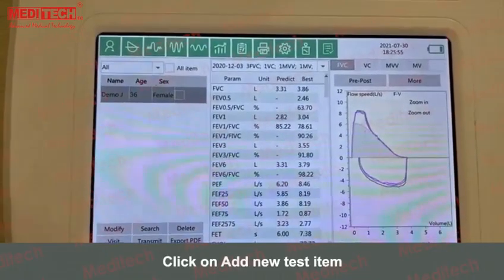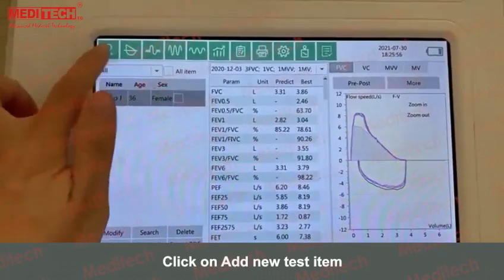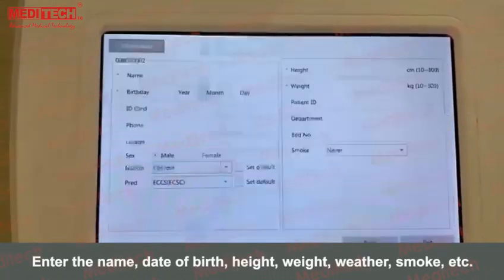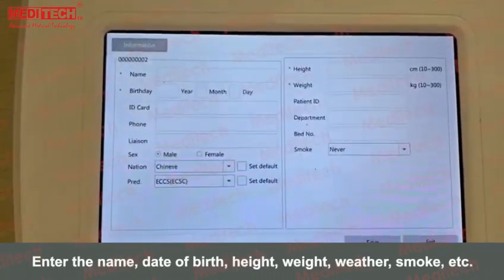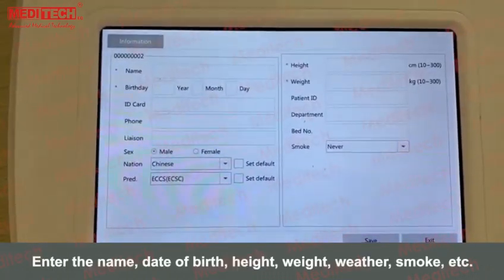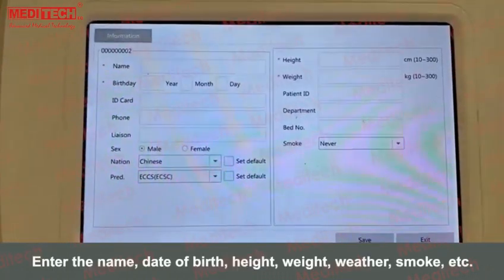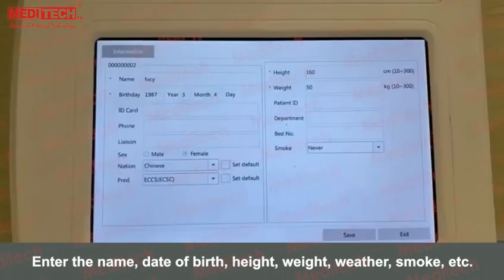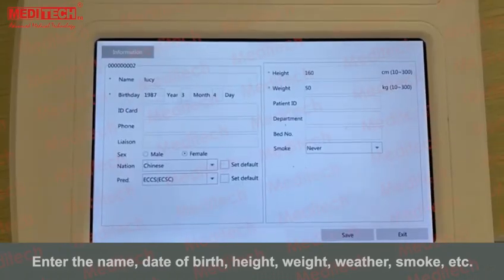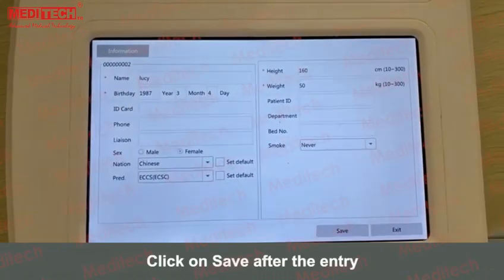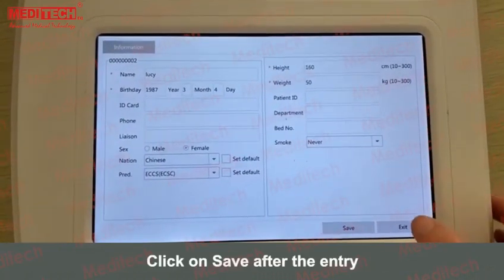Click on Add New Test Item. Enter the name, date of birth, height, weight, ethnicity, smoking status, etc. Click Save after the entry.